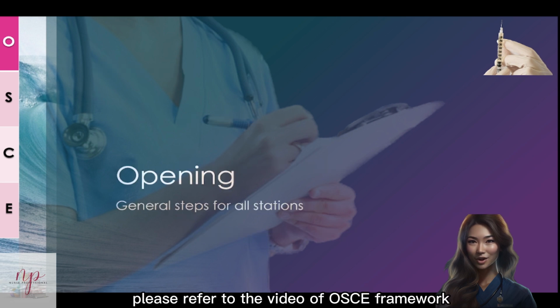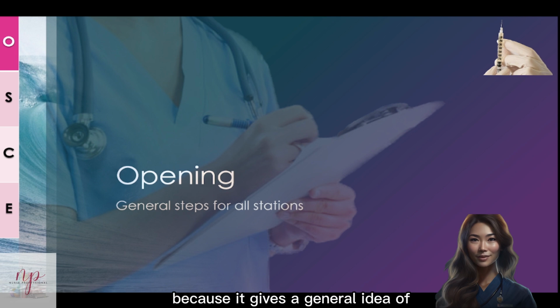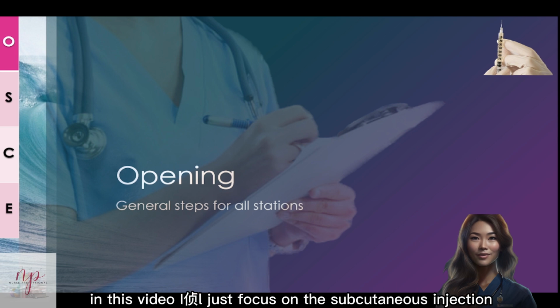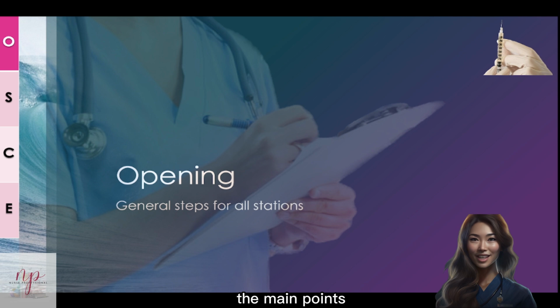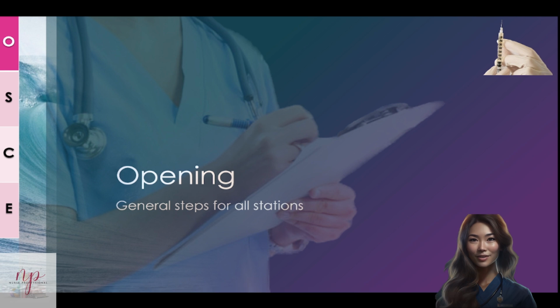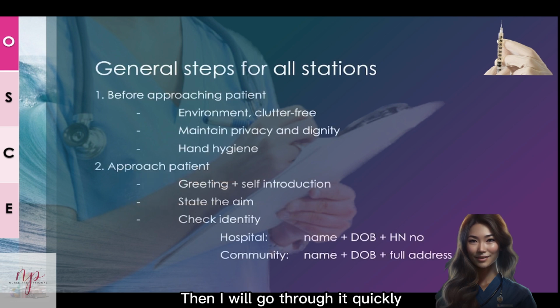Please refer to the video of the OSCE framework because it gives a general idea of what we should do during the whole procedure. In this video, I just focus on the subcutaneous injection, the main points. So for the general steps, please refer to the framework video. But I will go through it quickly.